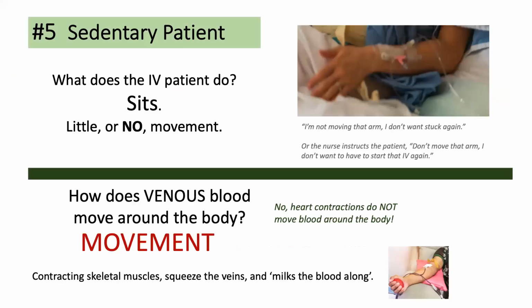Next, this has to do with flow, is the sedentary patient. Well, what does the IV patient typically do? Sit, don't move that arm, don't want to be stuck again. Or the nurse even says, don't move that arm, I don't want to have to start that IV again. Well, how does venous blood move around the body? We're all taught that. It's movement.